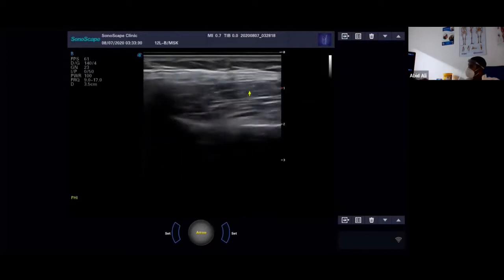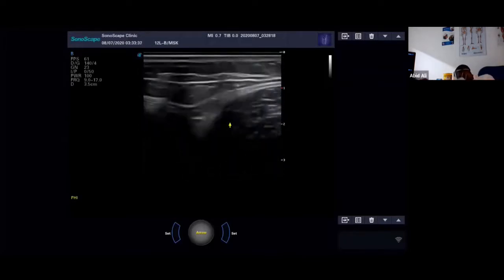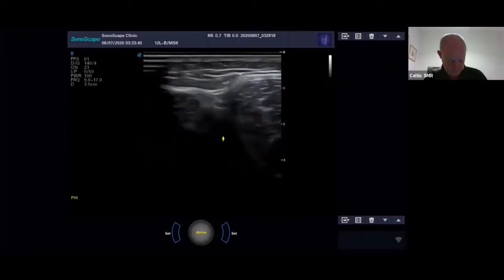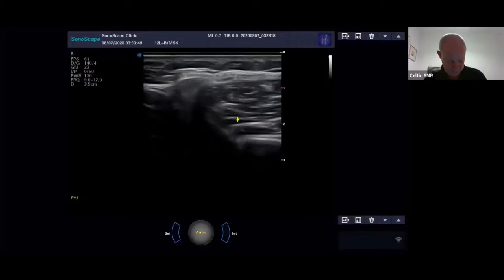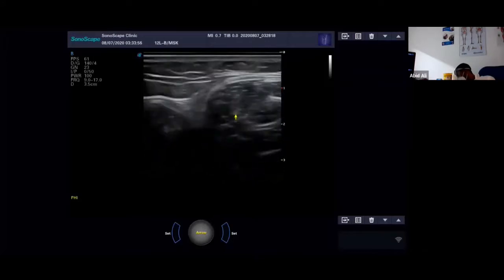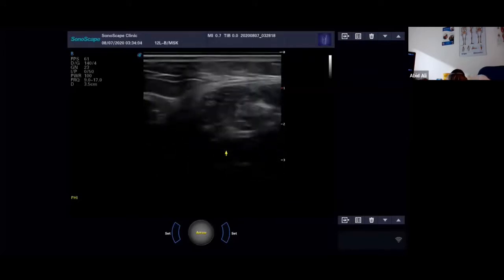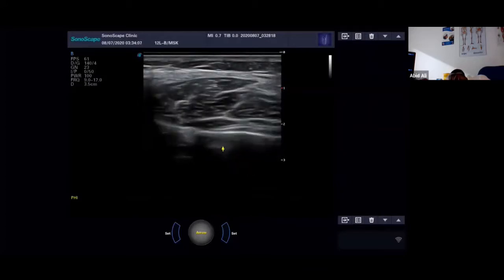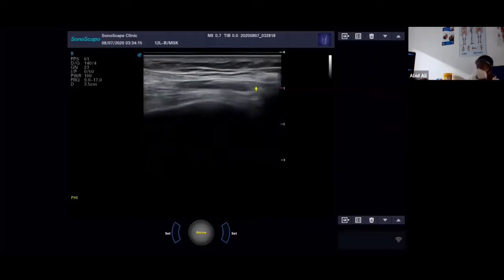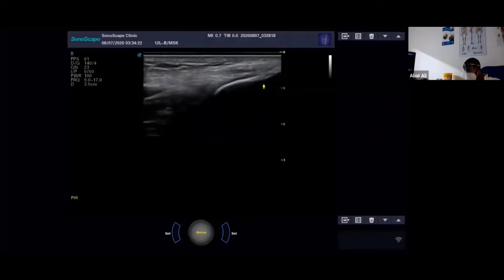So it's like there's short head. And then going into long head here. Back into short head. Okay, and then you're almost back into hamstrings and things like that. That's a different exam again. So you follow all these little intramuscular septa here. They all coalesce back to the fibular head. Fibular head down here, sorry. There.